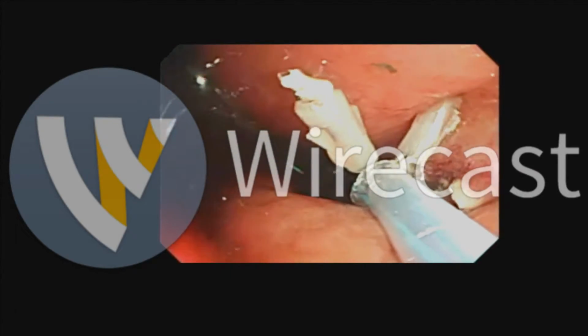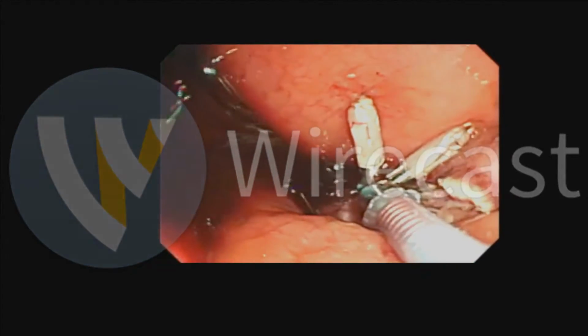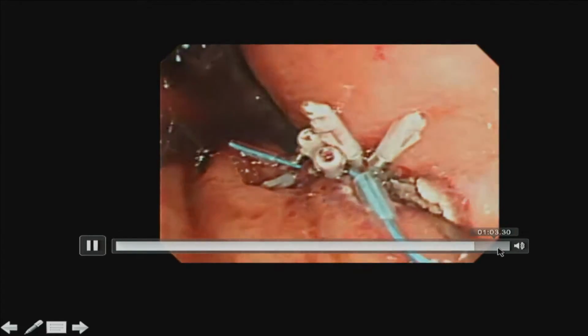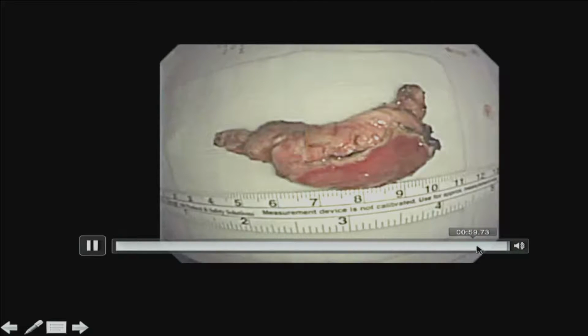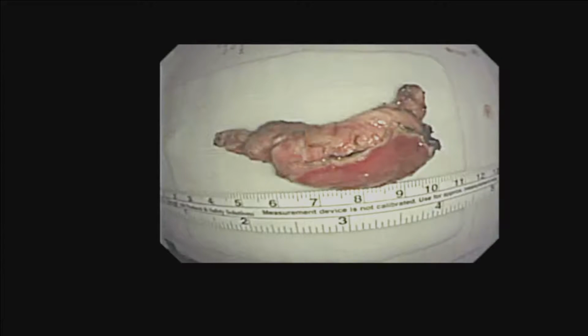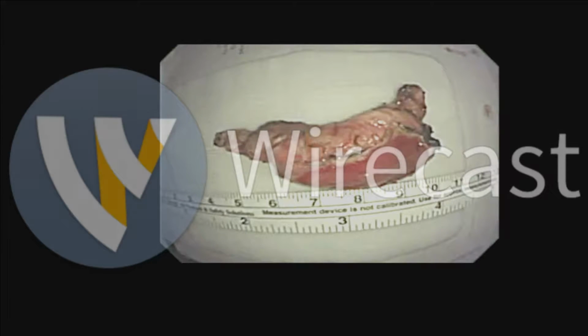As you can see, the perforated area decreased, and this is another endoloop application like this, and the big perforated hole gets smaller and smaller, and then try to do clip again like this, clip and clip. I'm sorry, like this. This patient didn't have any additional surgery, and the mass was measured at 5 centimeters, like this. The final pathology was leiomyoma.